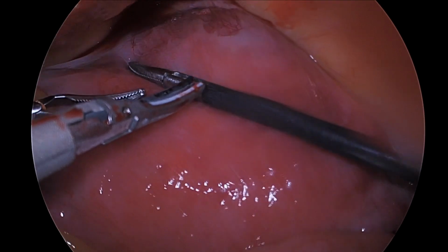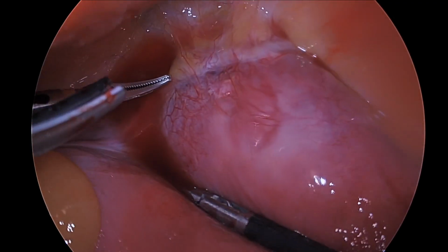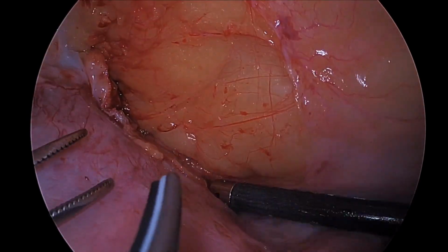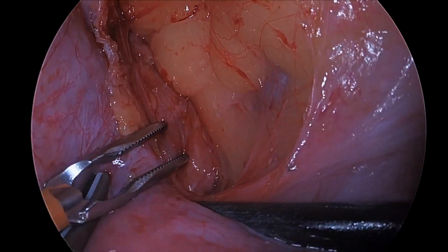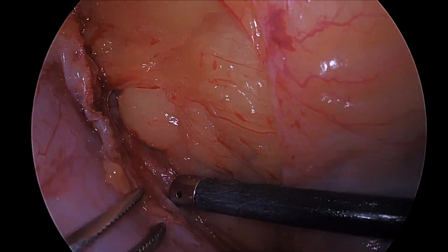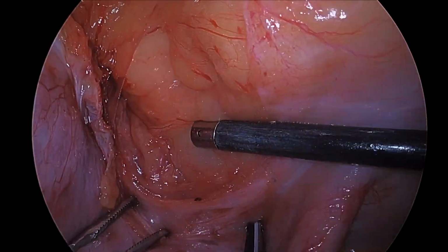The cesarean scar ectopic pregnancy is easily identified as a bulge just cephalad to the bladder peritoneum. We plan to place bulldog vascular clamps prior to developing the bladder flap or placing a uterine manipulator to reduce the risk of significant bleeding. We initially started with an anterior approach to dissecting into the retroperitoneum. The paravesical space was developed on the right to attempt to identify the ureter and uterine artery.